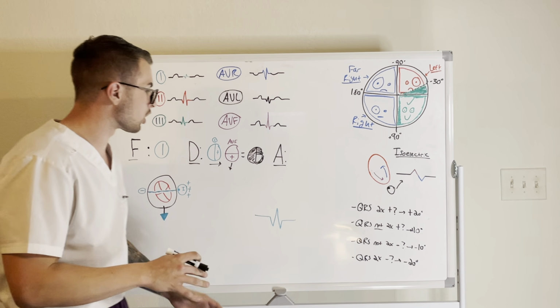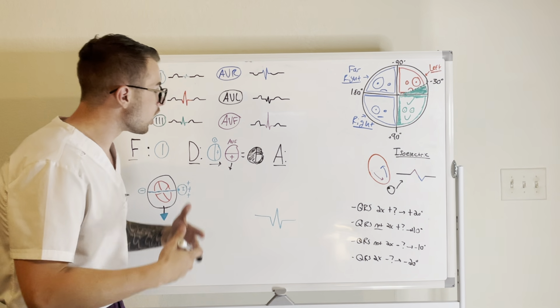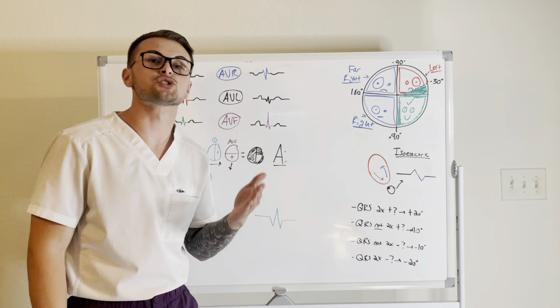Okay, so our last step is to adjust. We need to adjust the axis based on the isoelectric lead.